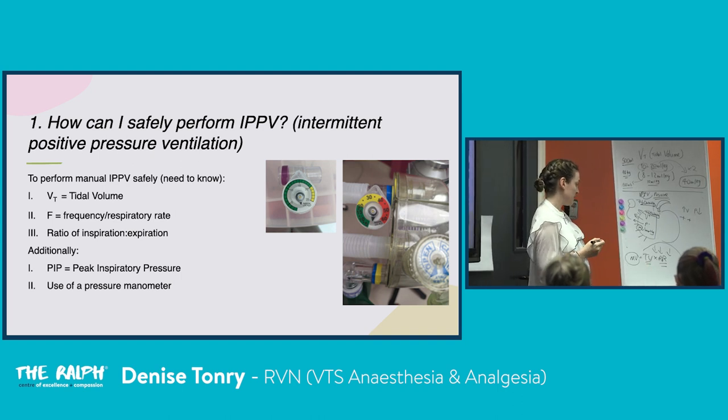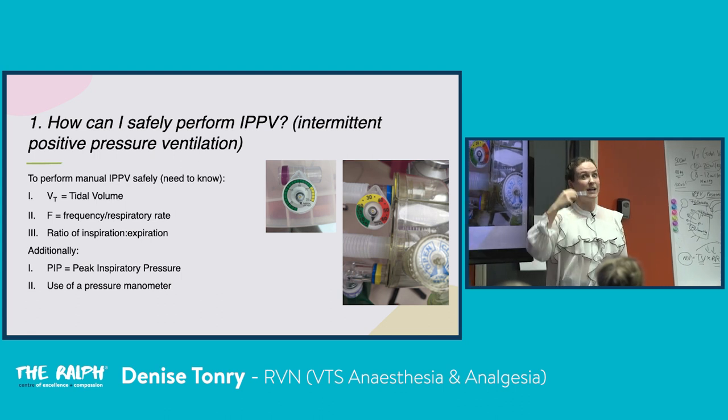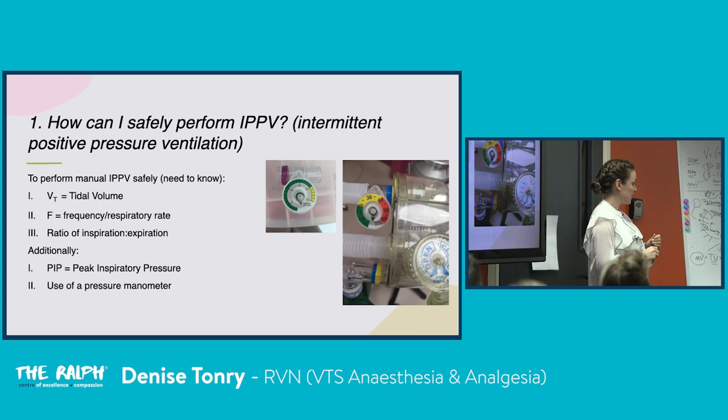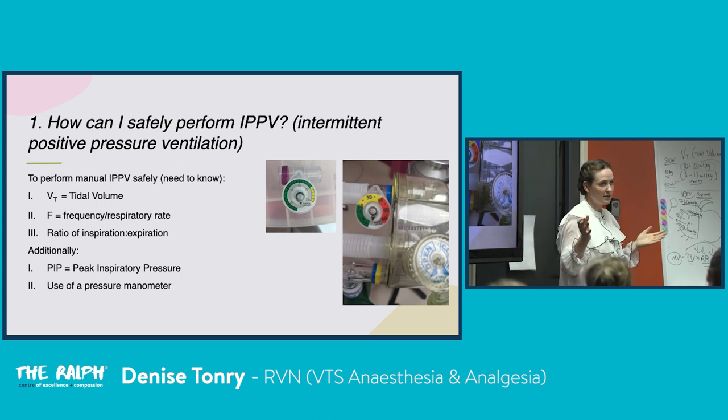Generally, as I said, sometimes I provide a higher pressure at 15. This will provide a higher tidal volume. And I add in the increased respirate. And that's to completely abolish the respiratory drive and bring the carbon dioxide down. If you have a patient that you would like to do that for because they have a high end tidal, 60, you can provide a tidal volume of approximately their weight, maybe 100, 200 mils, given the bag. If you have a three litre bag, it's a good idea to swap it down to a 1 litre bag if you're providing IPPV, just to remain safe.